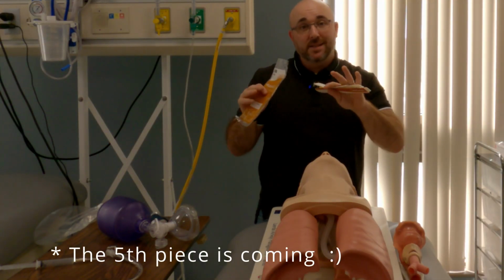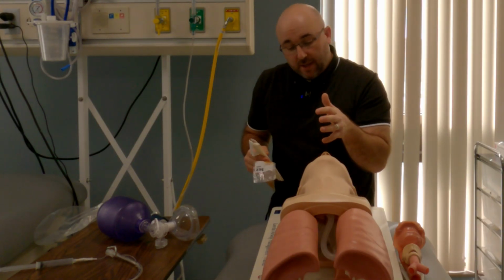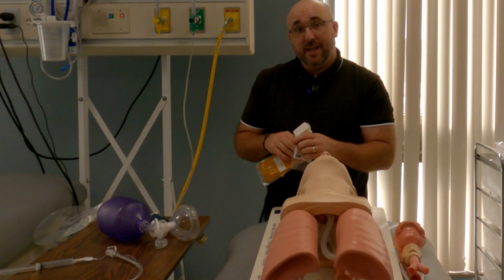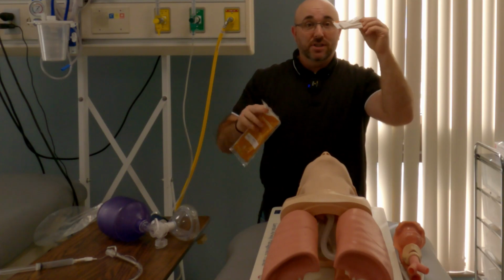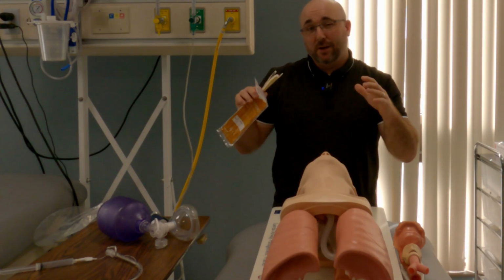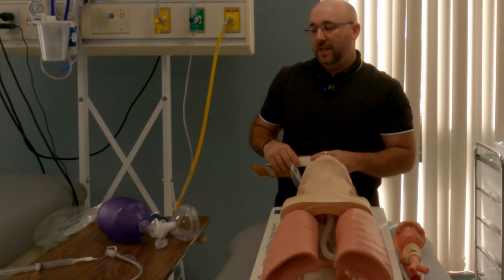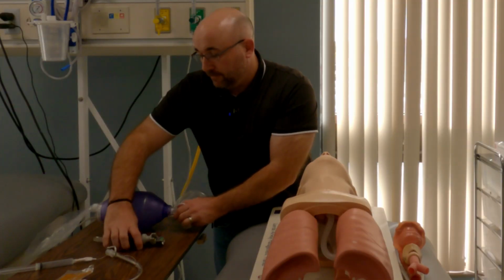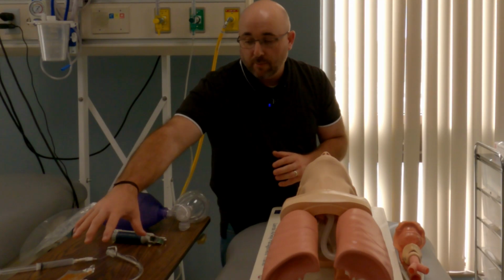These are 4 pieces that you really need to have because the person that's going to intubate this patient is going to secure this endotracheal tube with their fingers, and then the person that's assisting will then go to number 4, which is helping to secure that. I'm not going to go through that today because I'm just talking about the basics of assisting with intubation. So let's put everything in order here. Bag valve mask, laryngoscope, we have endotracheal tube, and we have securing device.